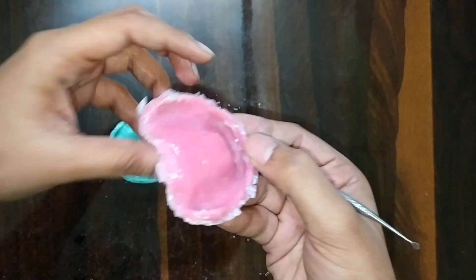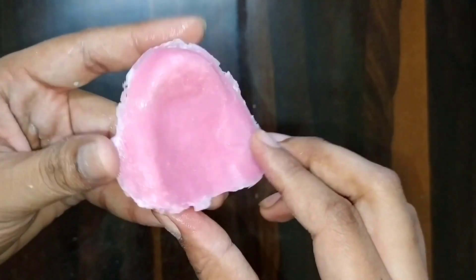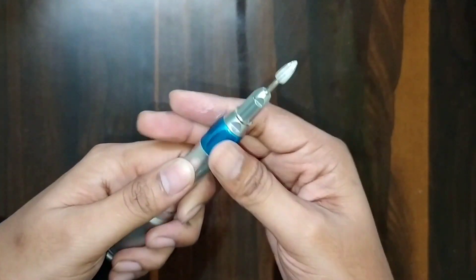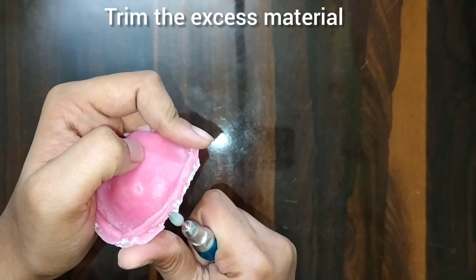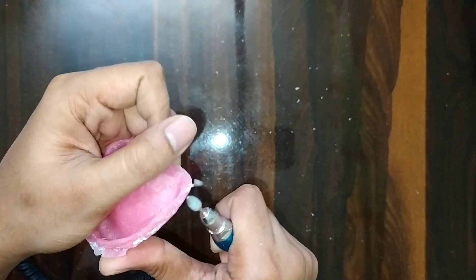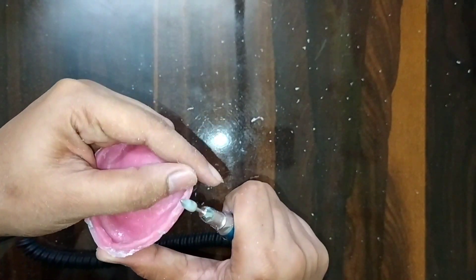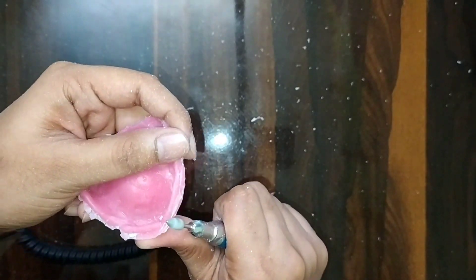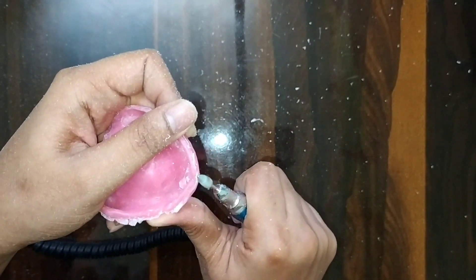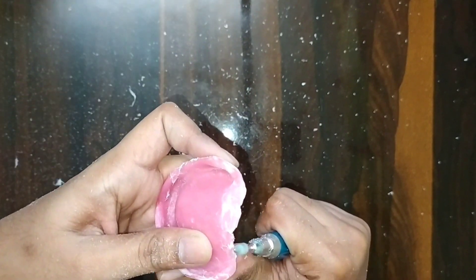You can see here that our denture base is almost ready, but a lot of excess material is left. With the help of the straight handpiece we will remove the excess material and trim it till the sulcus.